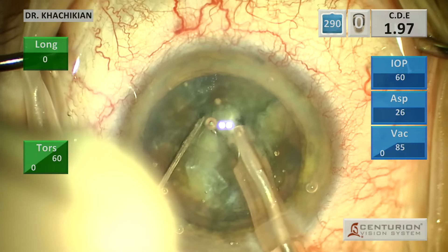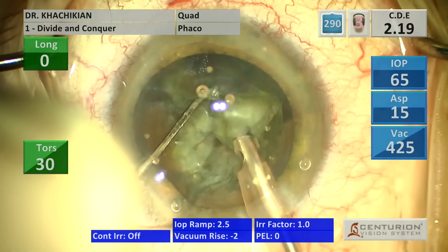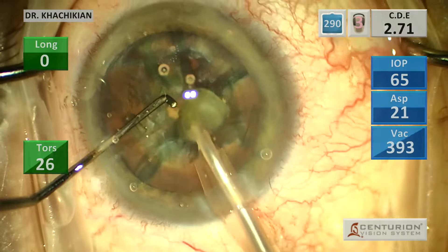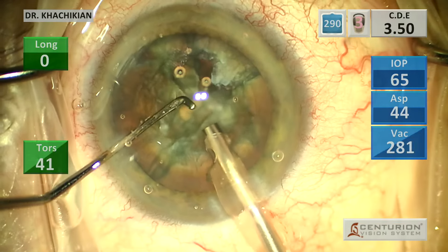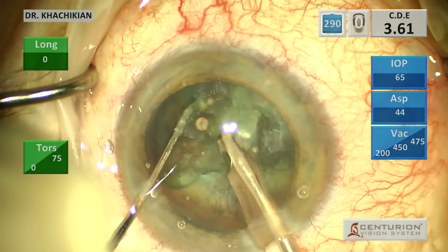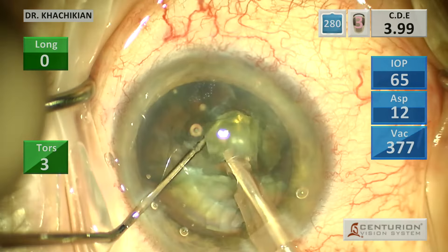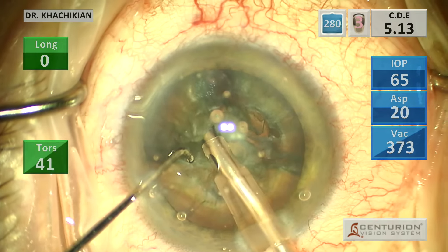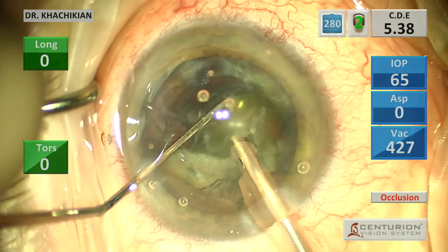We made a quadrant, but that quadrant is pretty big and it's stuck in the rest of the lens — it's not really well separated. We'll see if it comes out. There we go, we got it out. Notice the primary handpiece is just central; it's not moving very much, there's not a lot of motion. Wiggle it a little bit to kind of adjust the piece of the cataract on the tip of the handpiece, then we'll chop again. Most of the energy here is just breaking up and pulling out the pieces. We didn't do a lot of sculpting because it was going to take a lot of energy, and you don't need to. If you can sculpt it to a depth where you can crack safely, then you can switch to quadrant removal mode and chop the rest.